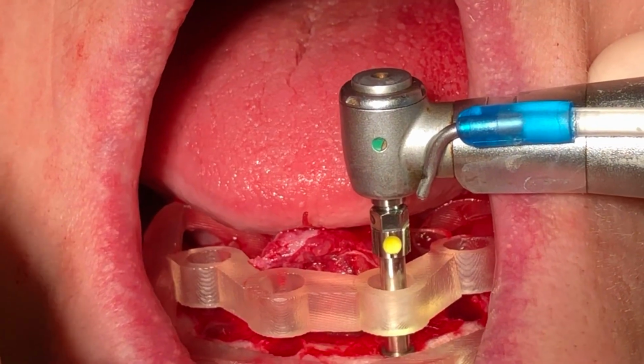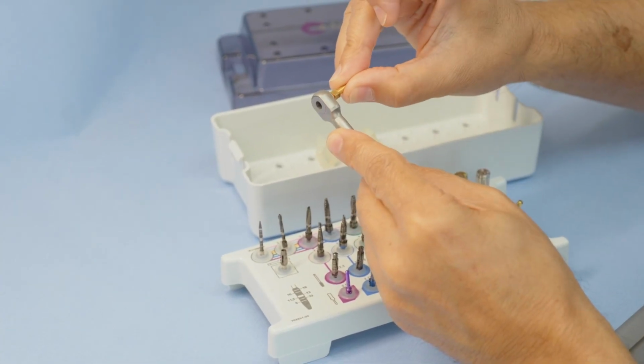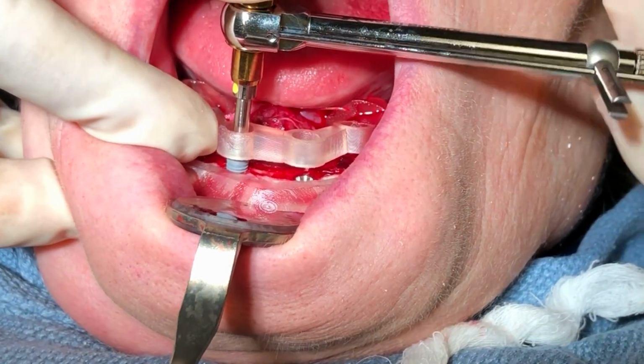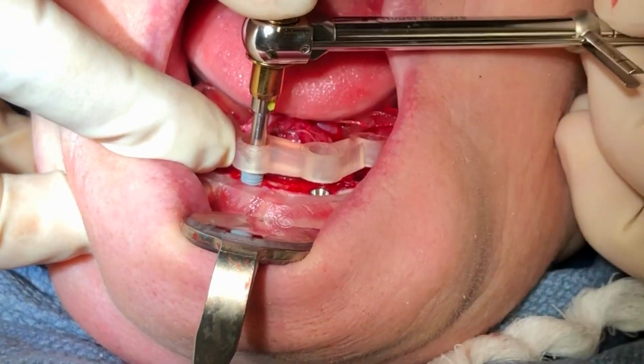Now, the implant is going to stop drilling once you get to that 30 to 35 newton centimeters of initial torque. And once that happens, you're going to have to retrieve the motor, and now the rest of the insertion should be completed by hand. There's a separate tool that goes in your torque wrench that you then connect to the implant and start inserting your implant by hand at this point. By using this torque wrench, it's also going to allow you to see what is the final torque that you are gaining at the insertion of your implant.